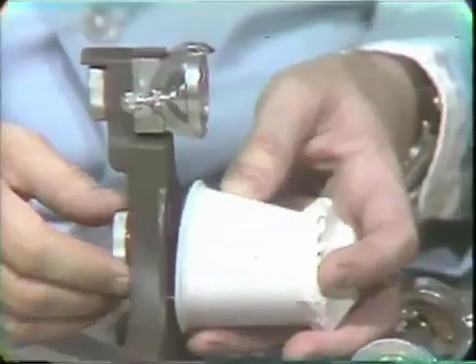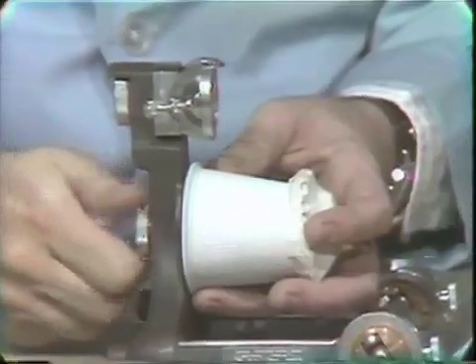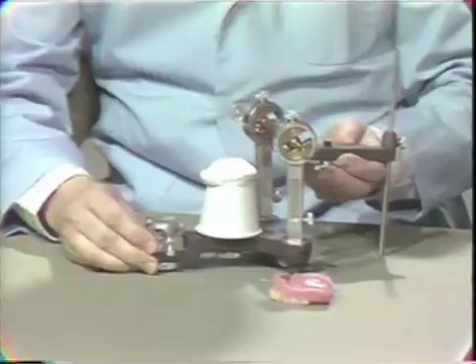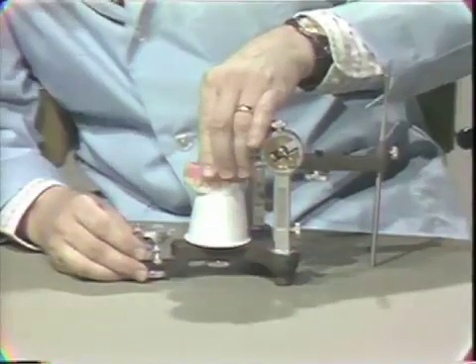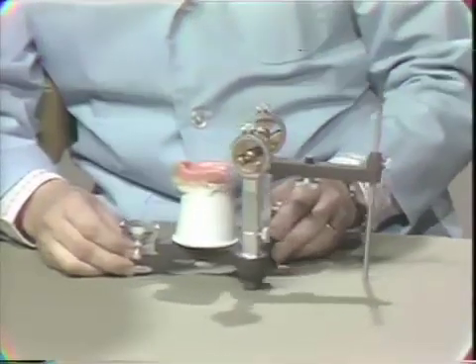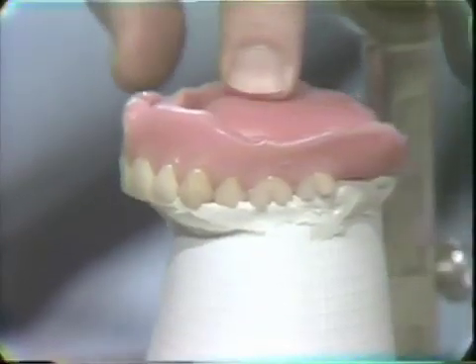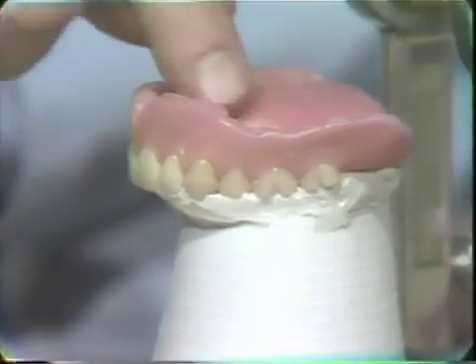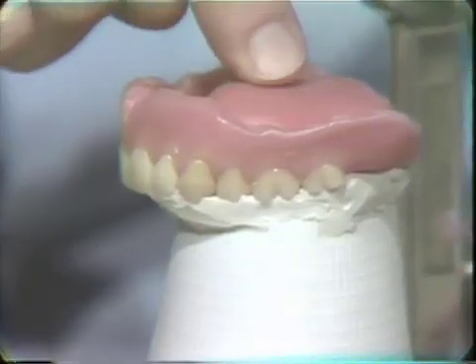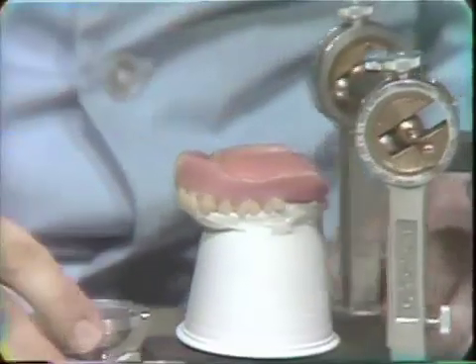We do not have to make another face bow registration from the patient. This simply goes back onto the articulator like so. Now the completed denture — you can tell by the way the teeth join the plaster that it fits very well. Then what we do is block out the undercuts in the upper denture. Now some of you have asked: if we lose our master cast, how can we remount a denture? And this will be where that is demonstrated.